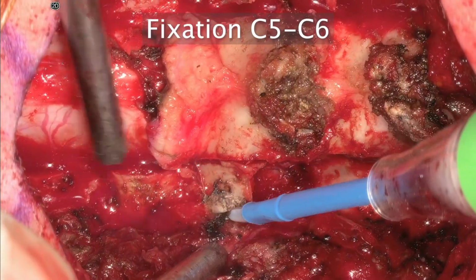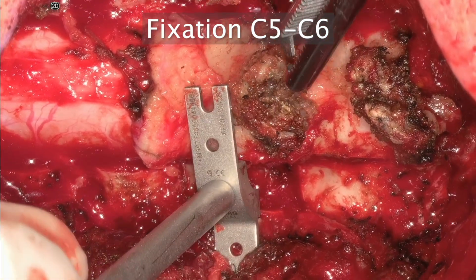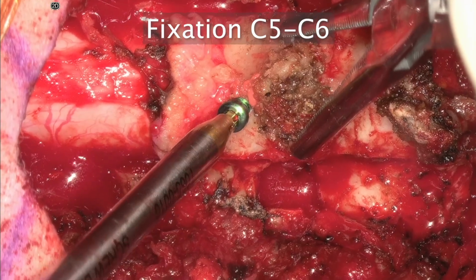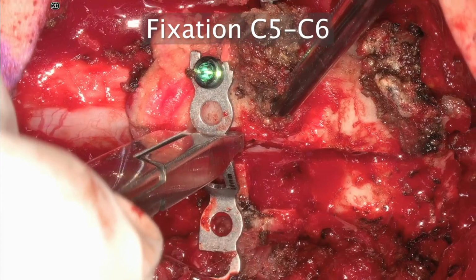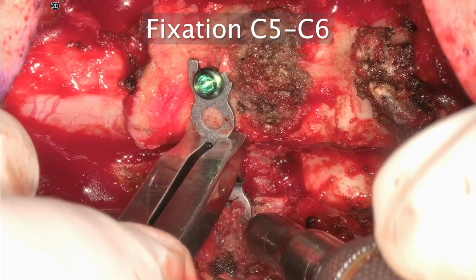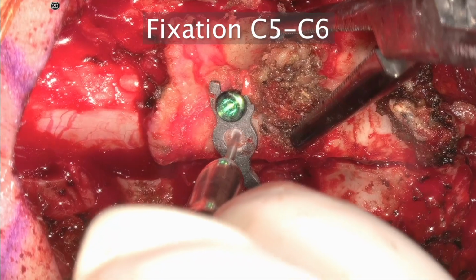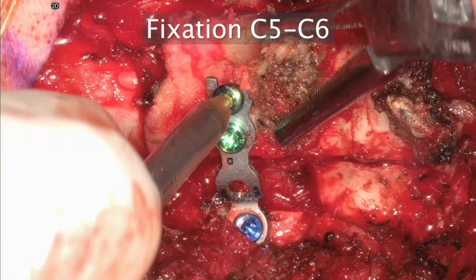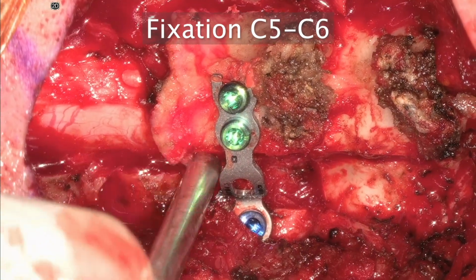The placement of the plate and screws somewhat depends on the system being used. In this particular system, we place a screw and then hook the plate onto it, which allows for good control. The green screws, which are the laminar screws, are 4 millimeters in length and 2 millimeters wide. However, in the lateral mass, we have screws that are 8 millimeters long, which are more of your long and strong screws, which are anchored in. Really no difficulty whatsoever getting these small screws in.